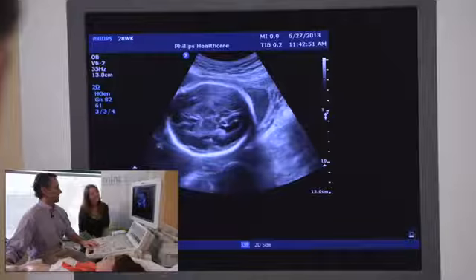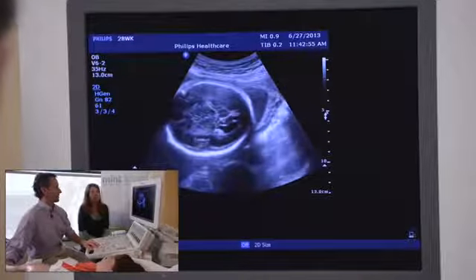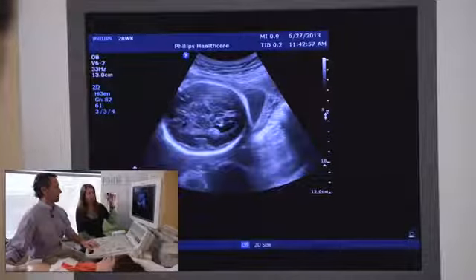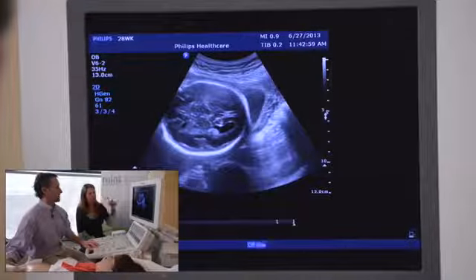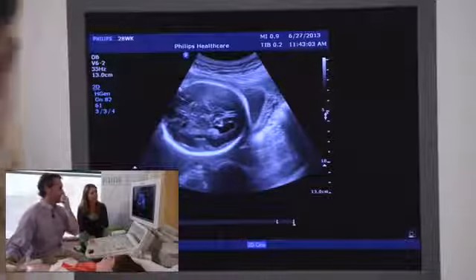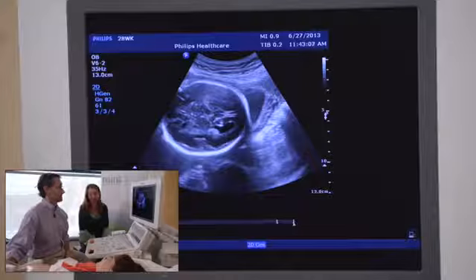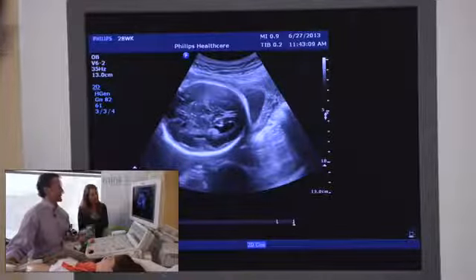The downside anatomy of the brain is always a little bit easier to see than the anterior superficial side, just due to the proximity of the skull. So you get that anterior artifact of the reverberation, so that the downside is always easier to see.